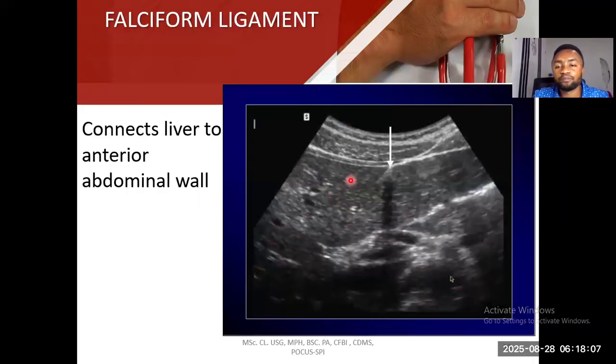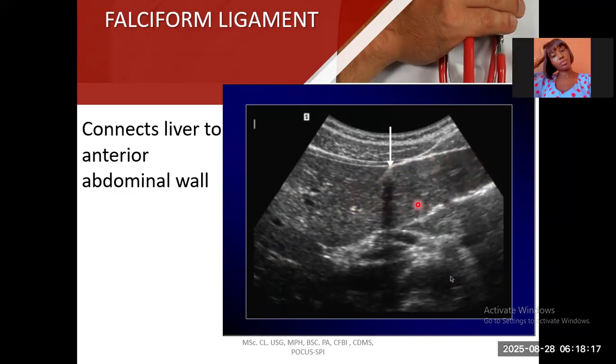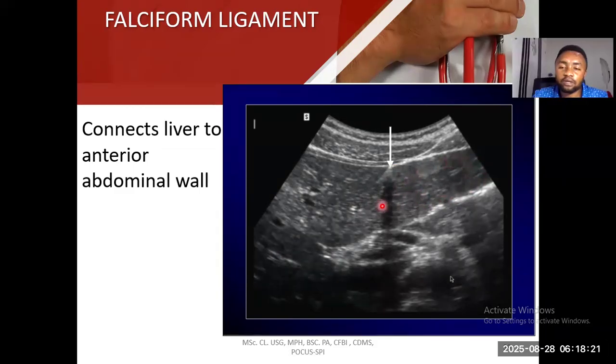All right. So who can tell me which part of the liver this is? Which lobe is this? Yeah, the left. Okay, the left lobe, because I didn't hear you earlier. That's the left lobe. Once you see the lobe elongated, thin like that, then you know it is the left lobe, because the right lobe is not that elongated.